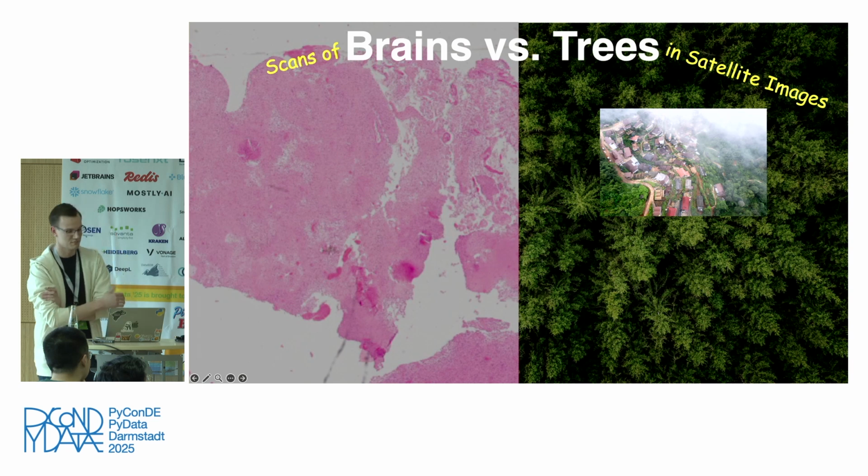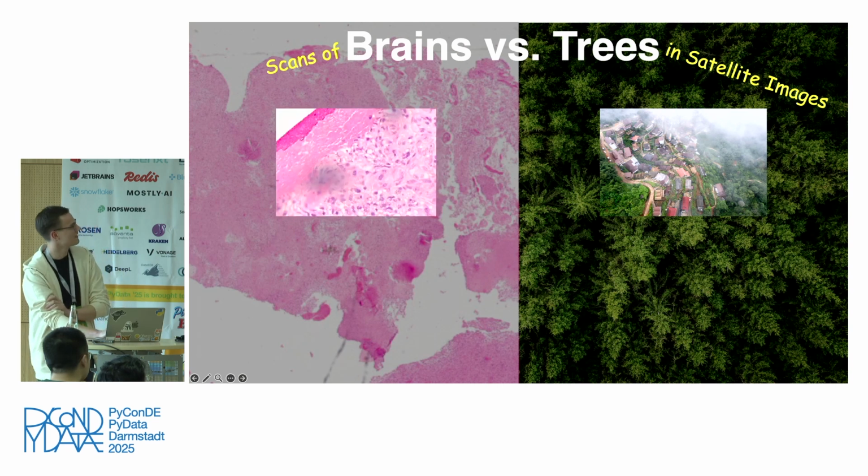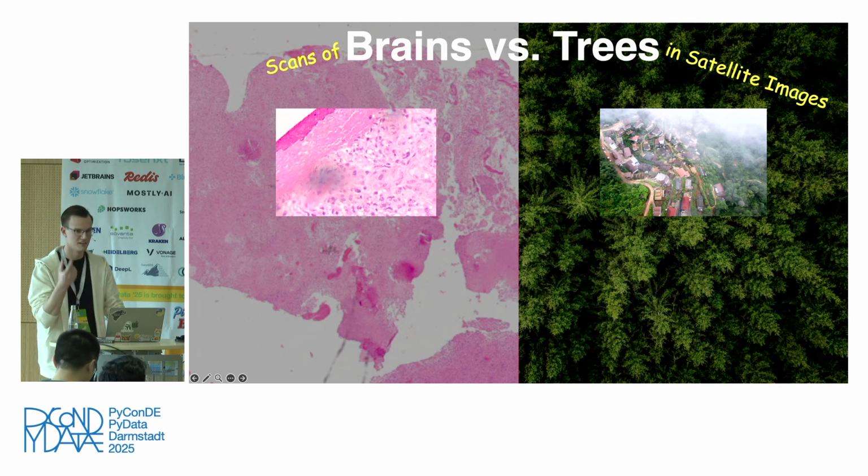but I didn't find any beautiful satellite image. What we can see in here is a lot of fog or a cloud in our image. And if you look at the pathology domain, the contrast isn't that good, but right here you can see a dark, not focused area, which is actually a little bit of dust on the pathological slide. They look quite similar to me.